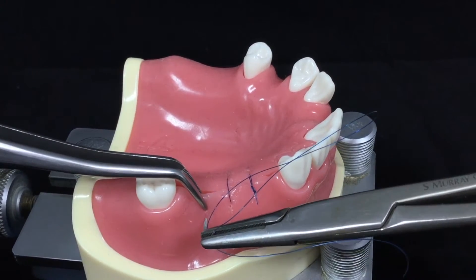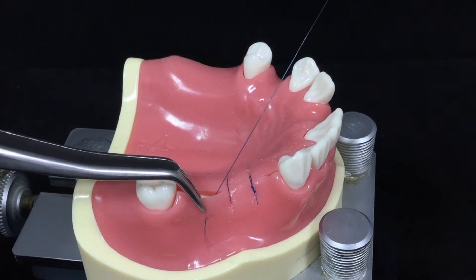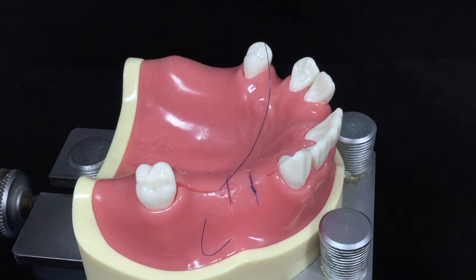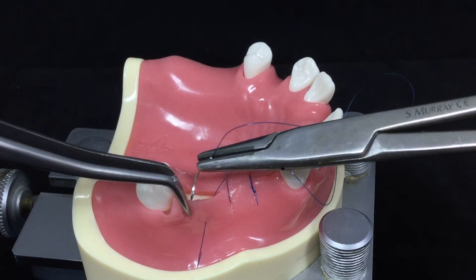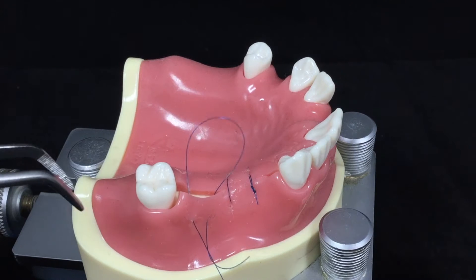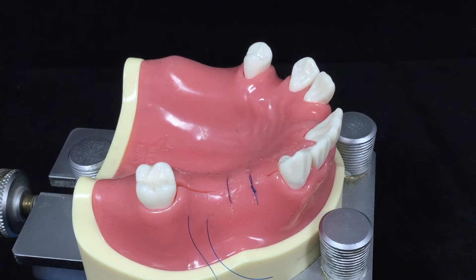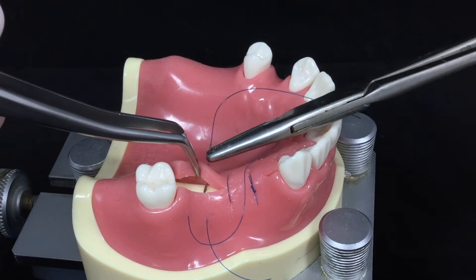This is the criss-cross suture, which is very similar to the horizontal external mattress suture on the right side. First, you engage the buccal flap from mesial to distal direction, which is the same procedure of the horizontal external mattress suture.